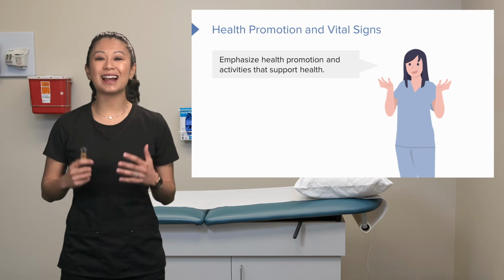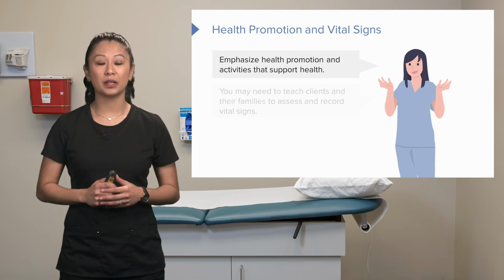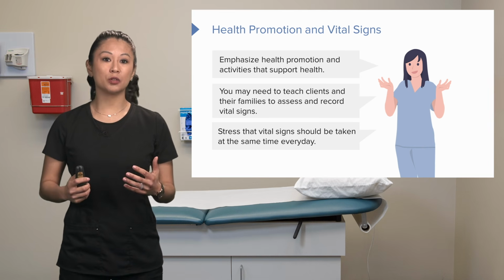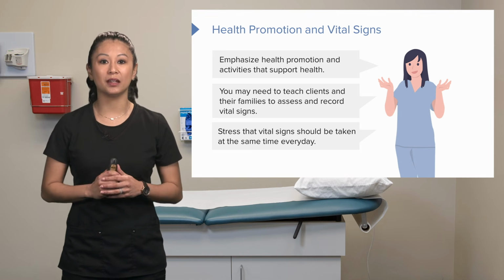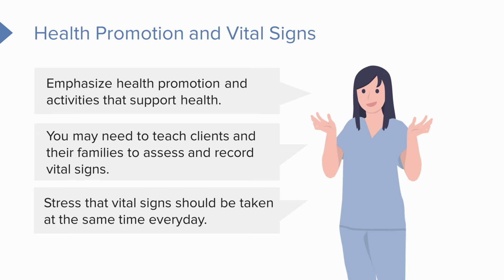We talked about many guidelines for measuring vital signs. This helps emphasize health promotion and activity that helps support our health. So again, you may need to teach a client and their families to assess and record their vital signs. Also stress that these vital signs need to be taken at the same time every day. There's different times throughout the day that our vital signs are naturally going to change. So stress when you're doing education with your family members or your patient that they take them at the exact same time every day, if at all possible.